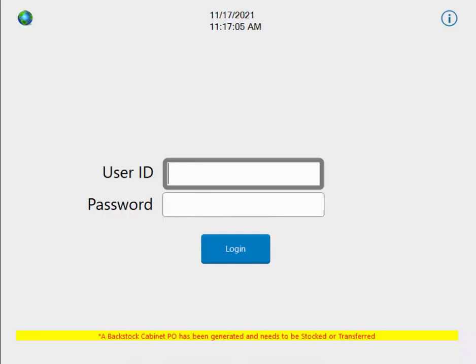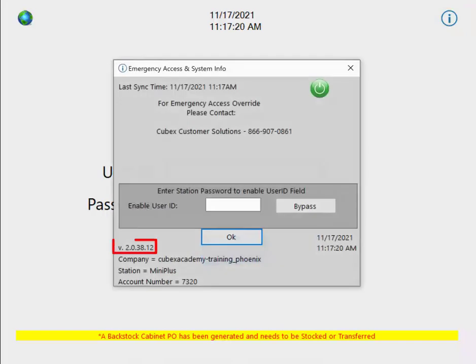In software release 38.12, the restocking workflow has changed. I will be reviewing the changes in this video. If you want to know what software version you are currently running on your Qubex, click the little information button in the top right of the login screen. This will show you your current version.